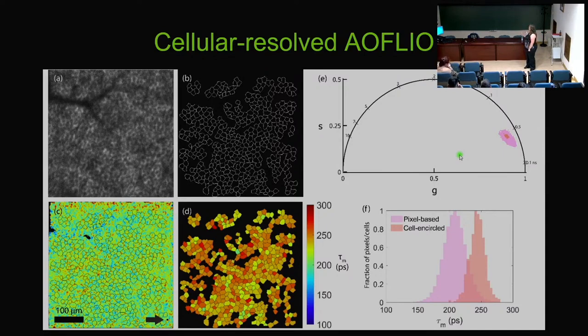At the same time, when you have very severe disease, like I showed you in some of the previous things, this pixel by pixel analysis will be easier to do. We can't always outline cells. And so this is, I think, a great way to start looking at early disease changes, but will not necessarily be helpful for us as we go to late disease changes. So again, a combination of both methodologies is what we want to continue doing in the future, but it's exciting.